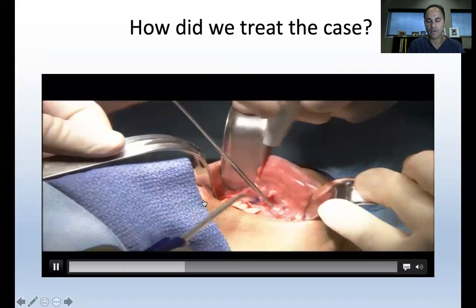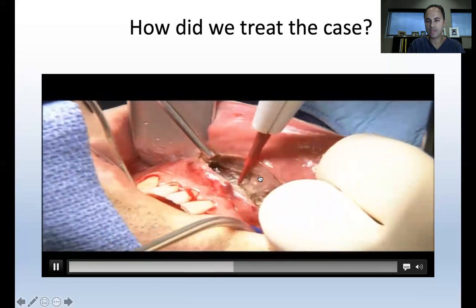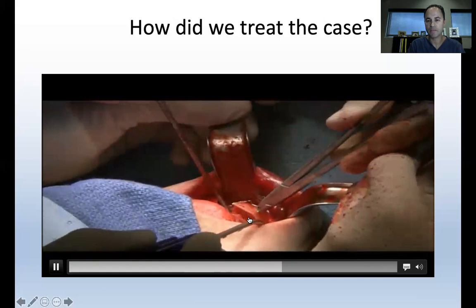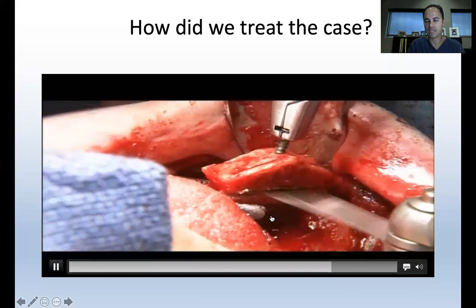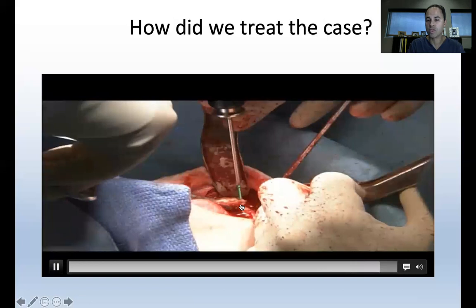Again, we're going to make an incision along the sulcus, above the genial space. We're going to cut through the mentalis muscle, use a sagittal saw to cut. Now, instead of the most inferior portion, we're going to cut a bicortical box, which is 1 centimeter above the distal mandible and 1 centimeter below the tooth roots. We're going to advance this bicortical aspect, exposing both geniohyoid and genioglossus, cut off the excess mandibular bone, and we can leave some for anterior projection. And then we're going to use one screw fixation from the anterior body of the mandible to the most inferior portion of the mandible.